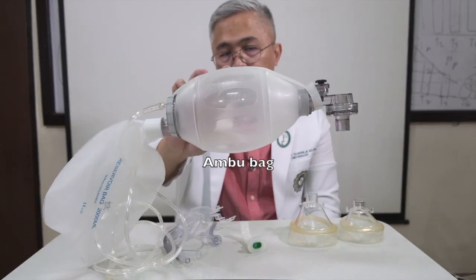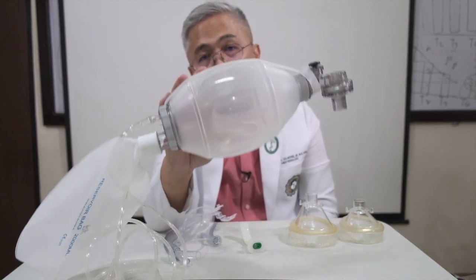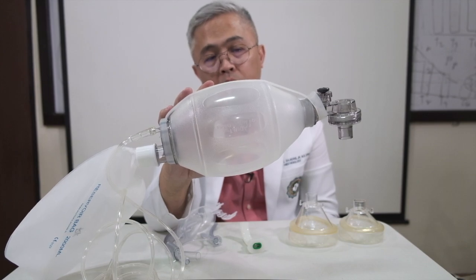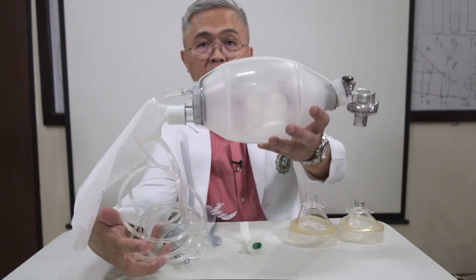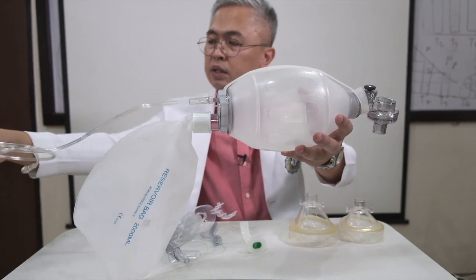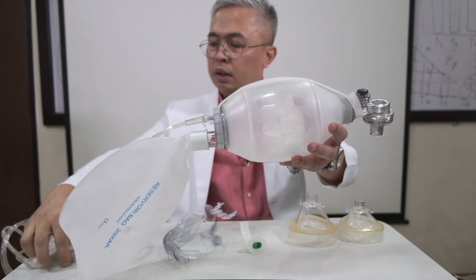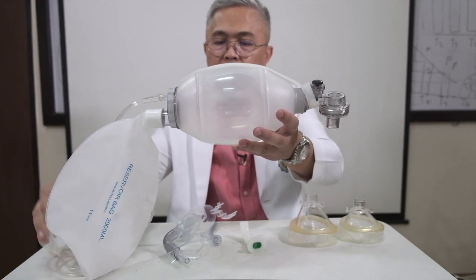An ambu bag, this is very common all throughout the hospital. We have this in theaters as well as in the recovery. This is very helpful to give oxygen to your patient. It comes with a tubing. This attaches to an oxygen tank or a wall oxygen.